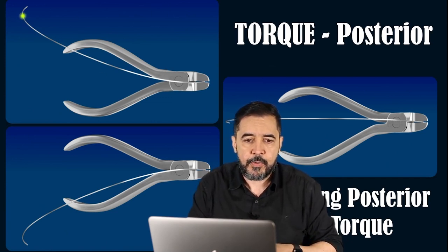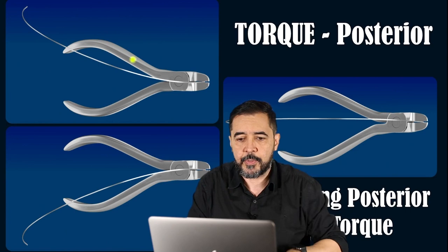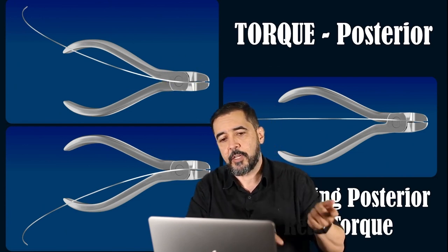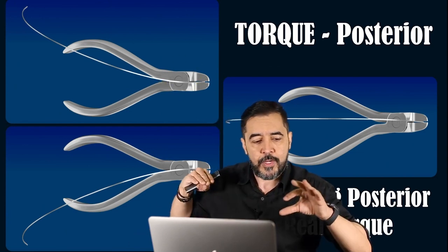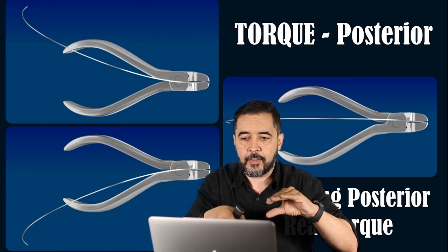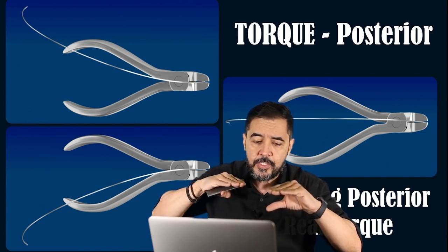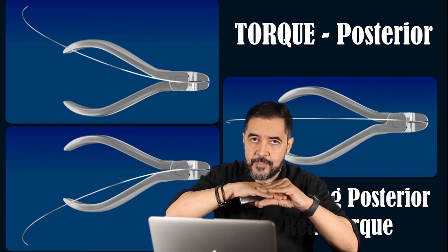If I grab the posterior segment, the opposite posterior segment is not being grabbed here. When I go down with it, to the level of the tube, in the opposite part of the arch, in which this tip is inserted, in which this rectangular wire is inserted.